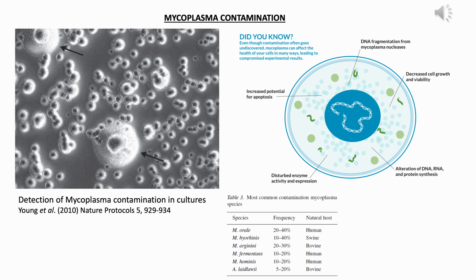Okay, and this is generally coming from the oral cavity of humans only. So one can say humans themselves are the major source. So if you are chatting too long, and in fact when you're chatting and spitting in the cell culture room, then essentially you are releasing this Mycoplasma orale into the environment, which can easily contaminate your cultures. Okay, in fact, 20 to 40% of Mycoplasma infections throughout the world come from this Mycoplasma orale.